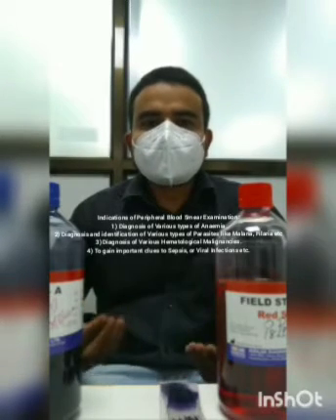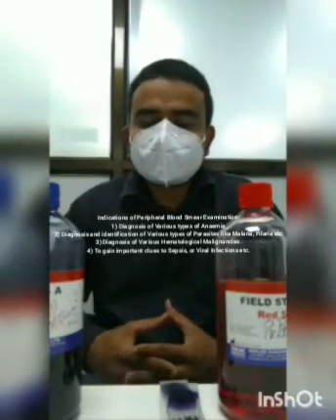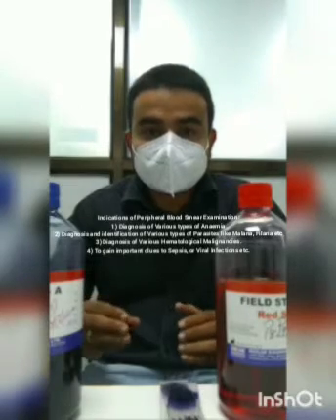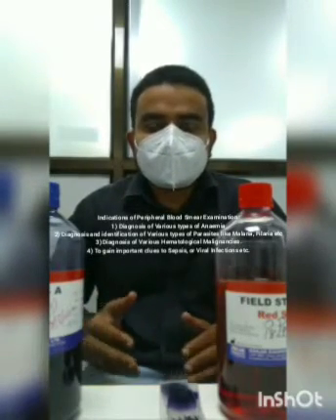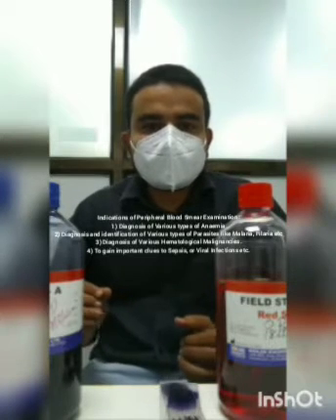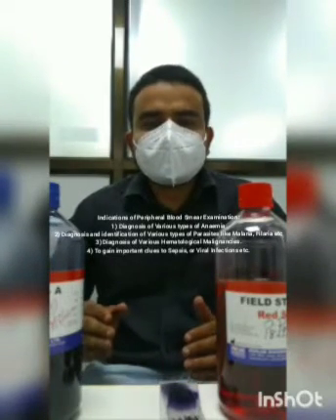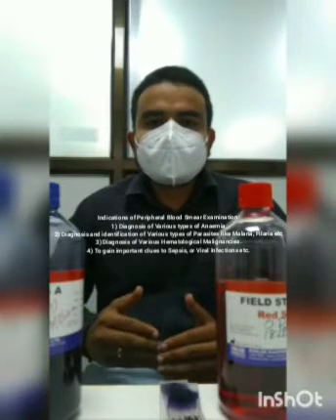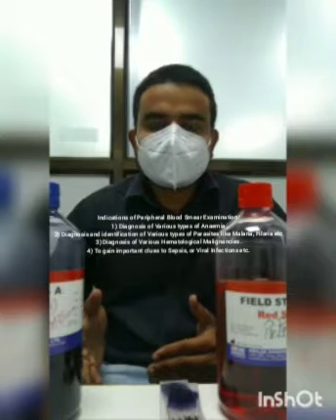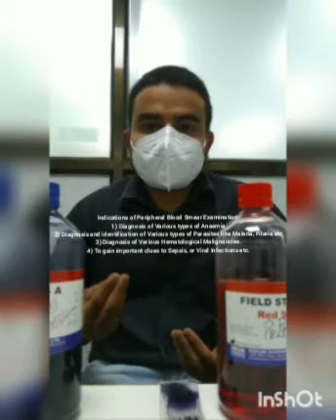The indication for peripheral blood film in hematology: it is the most basic test in hematology that a pathologist depends upon. Even before all the machines and all the advances in medicine, the peripheral blood film was the basic source of information that could aid clinical diagnosis. For many diseases such as anemia, whether nutritional anemia, hemolytic anemia, or other sorts of anemia, and some hemoglobinopathies, we can draw some conclusions from the peripheral blood film.